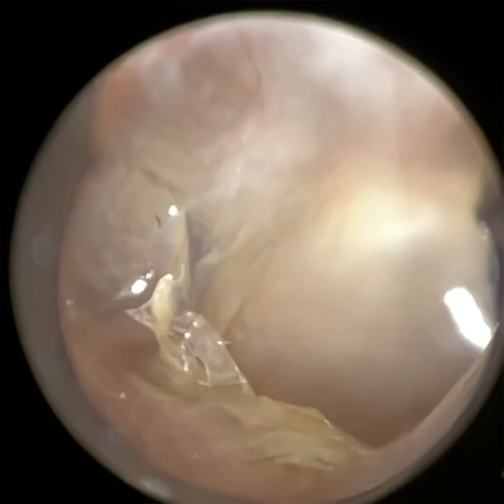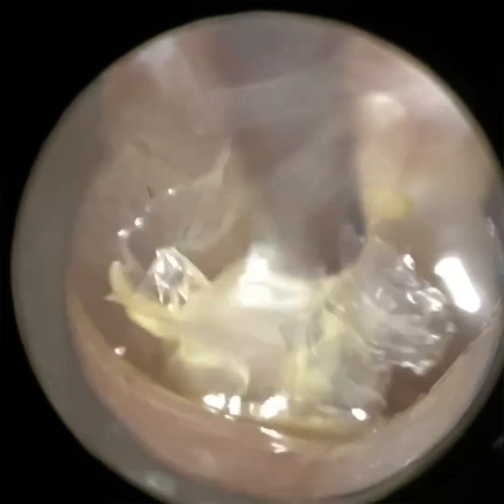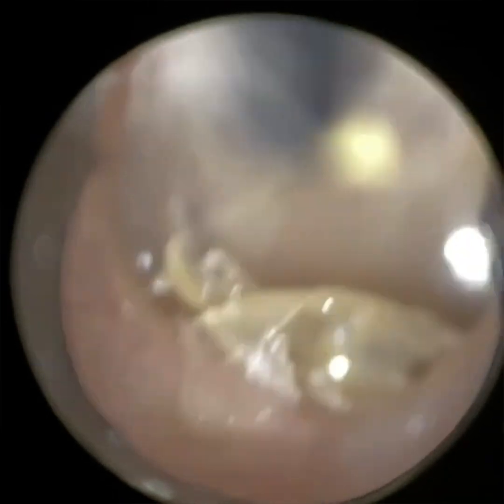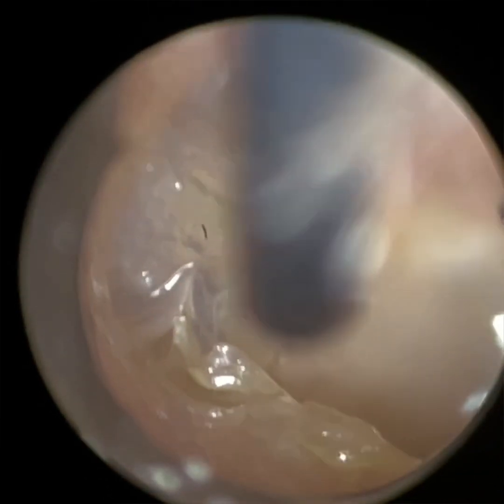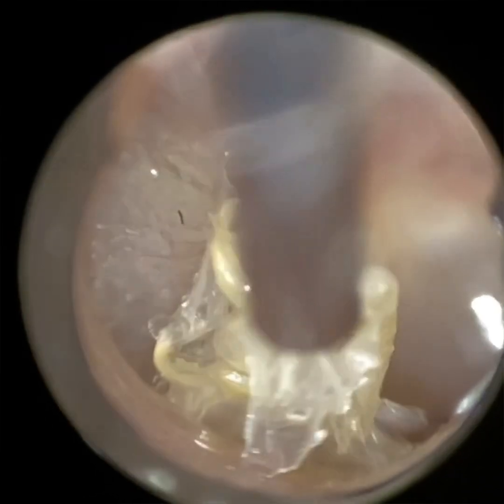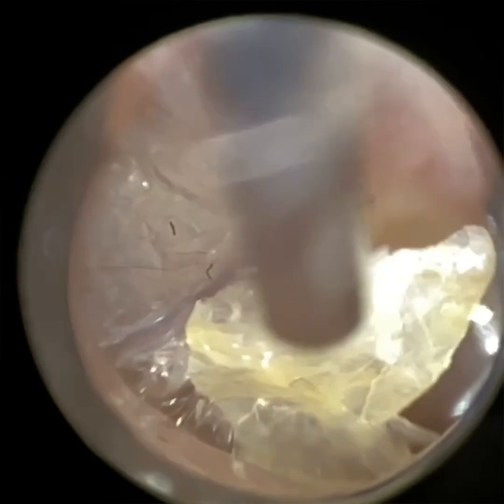You acquire it through a process called monocular vision. So you use focus, contours, distinct markers in the ear, motion parallax. Motion parallax is, imagine you're on the motorway or highway, and the cars adjacent to you on the fast lane will whiz past you, but objects in the distance will go slower. So it's that comparative difference between the speed of objects near to you and far from you, which can also give you depth perception.